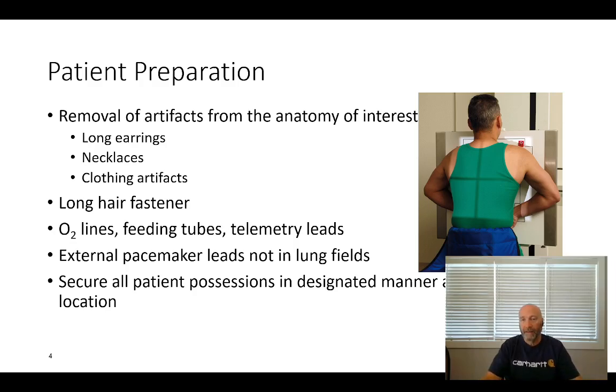So one thing about this image that just kind of works on me a little bit is that the top of the image receptor should correspond to that line, and our collimated field is above that by about 3/4 to an inch. So again, there's never any reason that the lines on your bucky indicate where the edges of the image receptor should be, and there's no reason to have light beyond that. Your light field, if your machine is calibrated properly, should correspond to the radiation field that you eventually create. So I just needed to point that out.